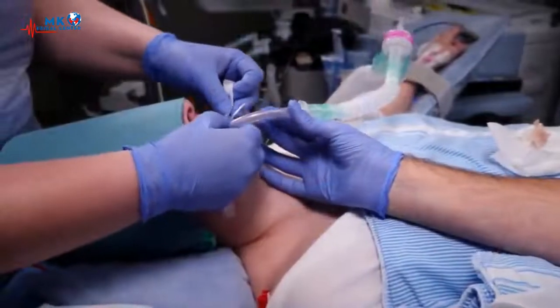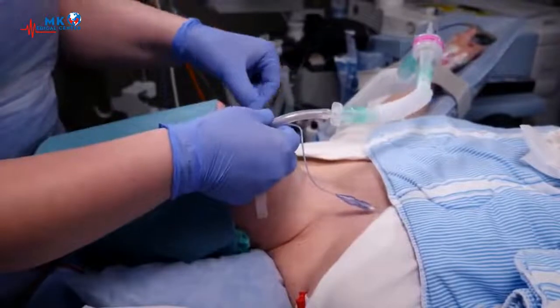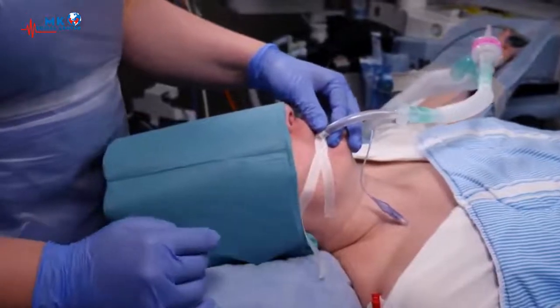When you're absolutely certain that the tube is in the trachea, secure it with tape and initiate mechanical ventilation. Congratulations, you have now performed an endotracheal intubation.